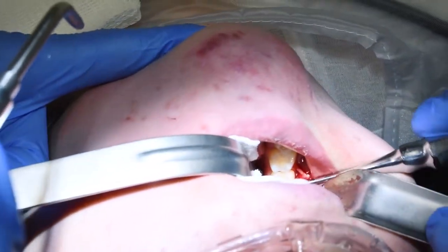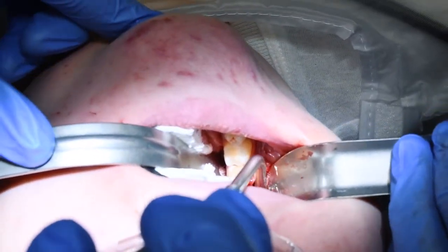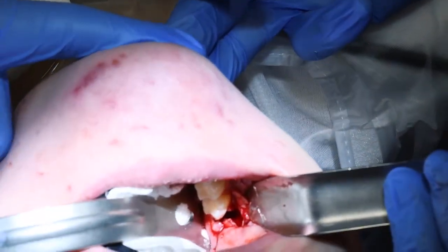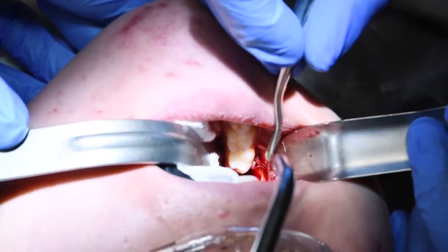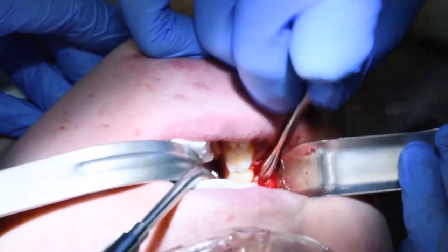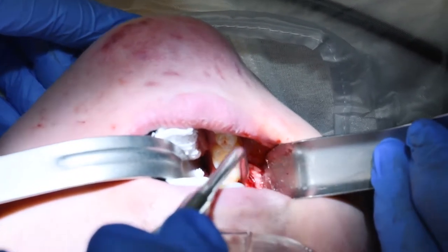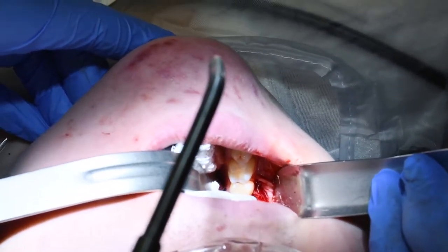Let's give it a wiggle — yes, look at that. It just popped right out — it kind of wanted to come out, which it did. Curette. Take a bone file first. I want to make sure things are smooth even though we didn't remove any bone. I always like to let people know that because I had to cut one side versus the other, it is going to be a little bit more tender and sore. We have a curette — it's just hiding on us.